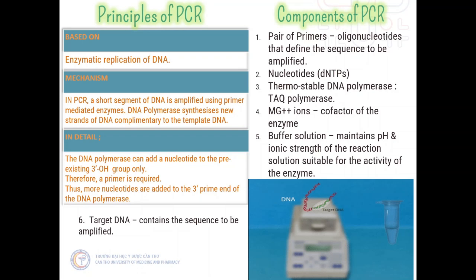The coronavirus is an RNA virus. When it infects an individual, more copies of the viral genome will be produced. PCR is a sensitive technique to amplify nucleic acids like DNA or RNA. In this technique, first we have to obtain the sample and purify it for nucleic acid, then convert RNA to complementary DNA. This is done because RNA is fragile while DNA is more stable.